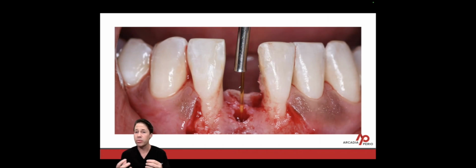Now remember, this tooth was removed because of an apical infection. I want to make sure with that light energy it penetrates deep beyond the laser tip. So I'm going to make sure that Nd:YAG laser technology, that wavelength of light, is going to eradicate any of those pathogenic bacteria that may still be around. It's just a safety measure. It's my insurance policy to myself. I do not want to go back in and replace this implant. So I'm going to do everything I can at the time of placement to ensure the best possible treatment outcomes.